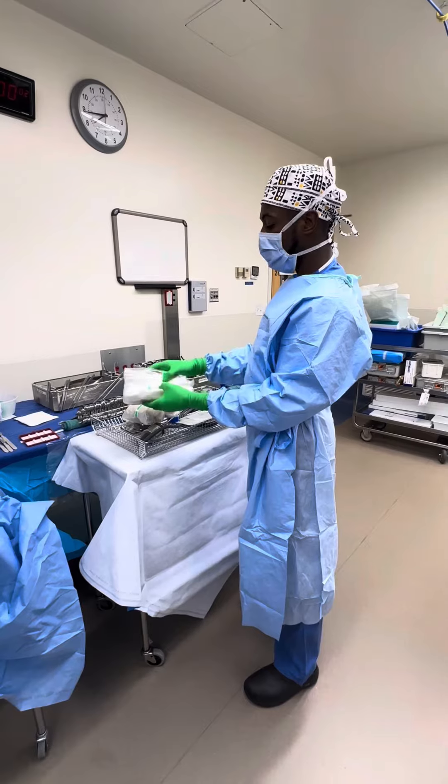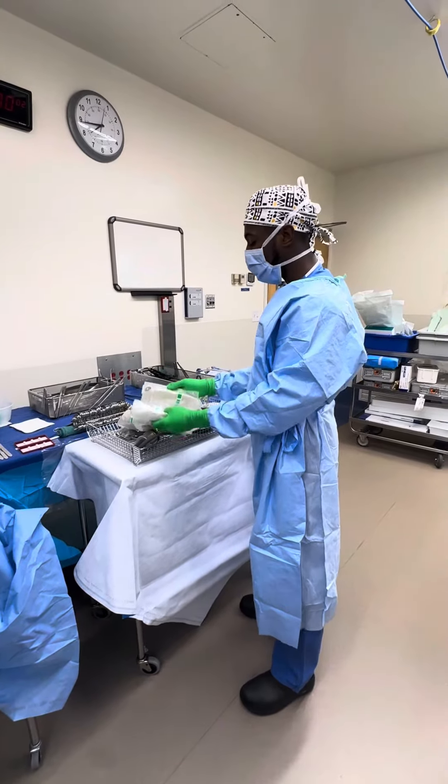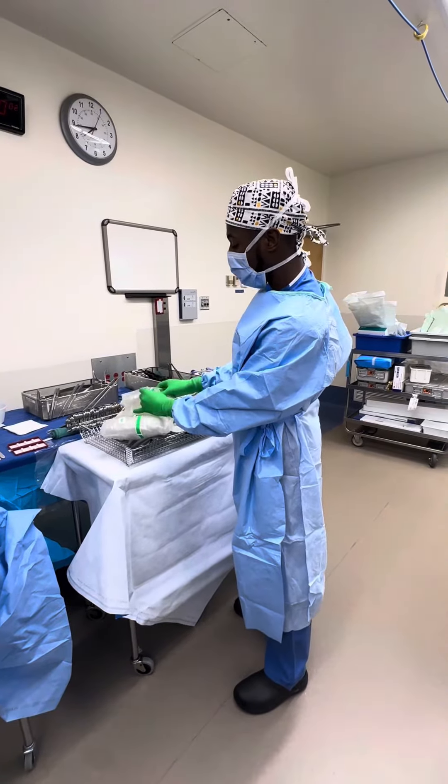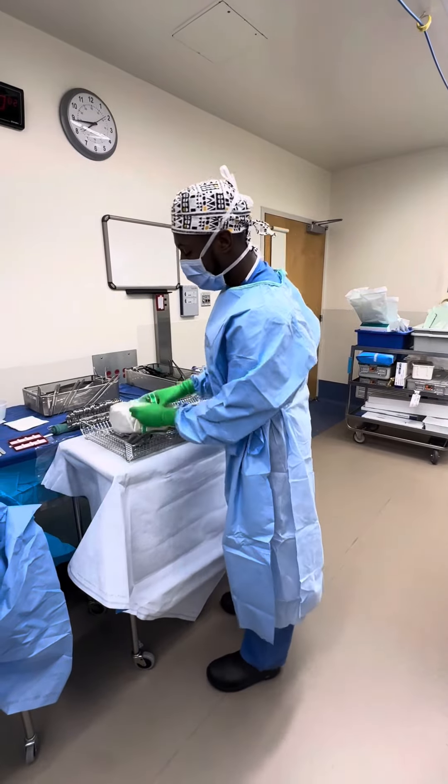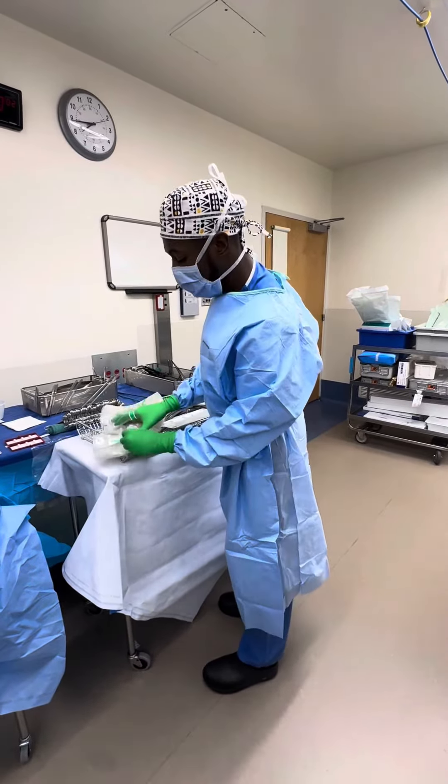I don't open it too much, just a little bit, and I kind of get a feel for where these hands are. There are like pockets for your hands — you put your hands in that pocket, and then you put your hands in this pocket.